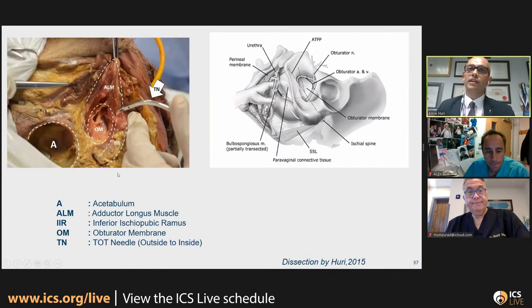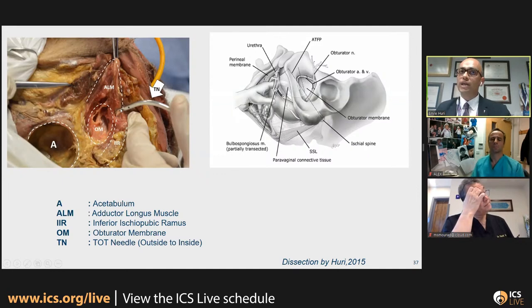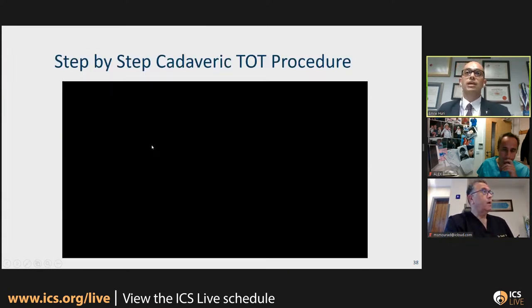Maybe we can go deeper with the obturator fossa dissection, then we can see the path of the anterior trocars. I would like to summarize the path and the anatomic location, from outside to inside, directly towards the vaginal side. First of all, the gracilis muscle, and we puncture the adductor brevis muscle, obturator externus muscle, obturator membrane, and obturator internus muscle, arcus tendineus fasciae pelvis, the paravesical space, and we take the trocar out in the vesicovaginal space.